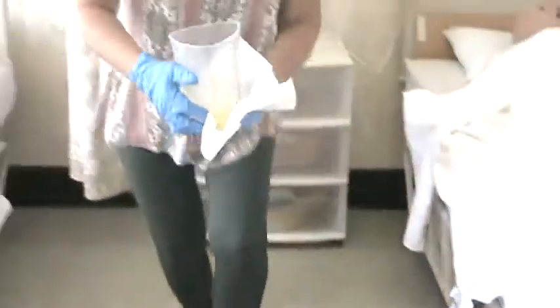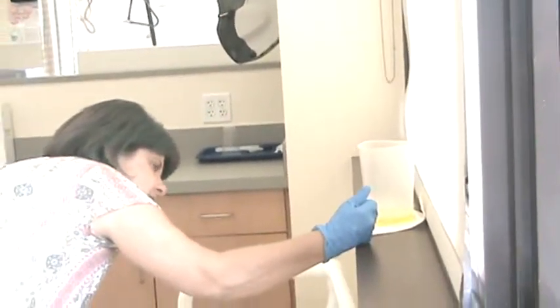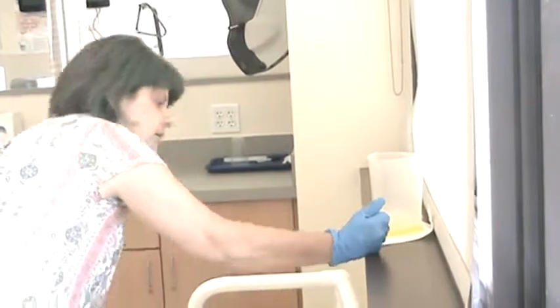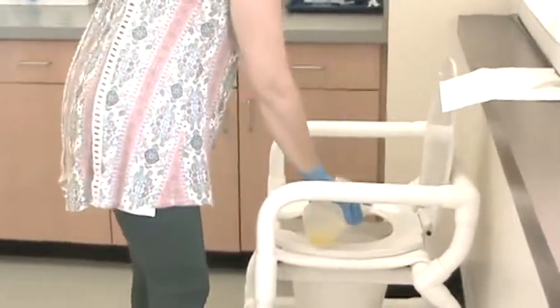Now I'm going to take the barrier and the container over to the windowsill, which is the bathroom. Set it down and look closely at it on a flat surface. I have 75 milliliters in there. You're going to record only in milliliters.